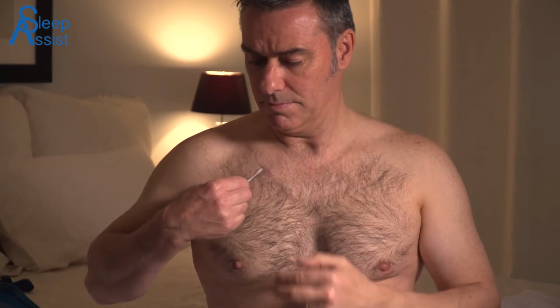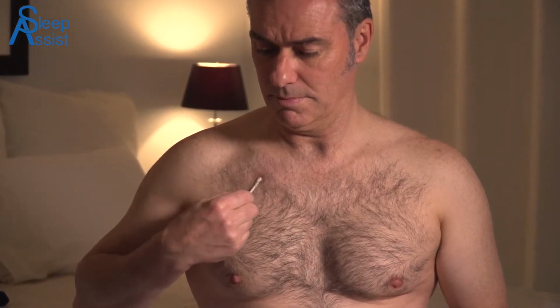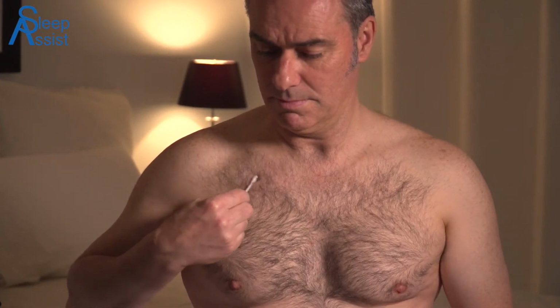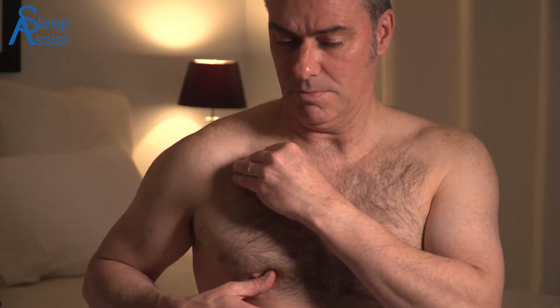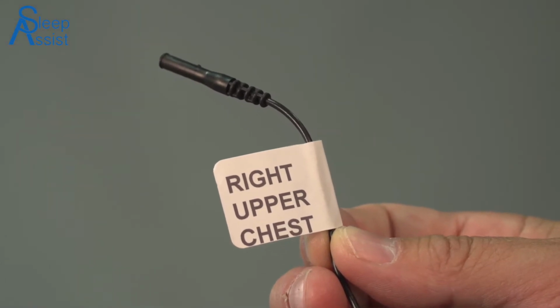Using a cotton bud dipped in New Prep, clean a patch of skin 2 inches below the right collarbone, approximately the size of a 50-cent piece, rubbing with the cotton bud for 20 seconds. With a fresh alcohol swab, wipe the area clean with 1 swipe only. Apply the adhesive electrode labelled right upper chest.